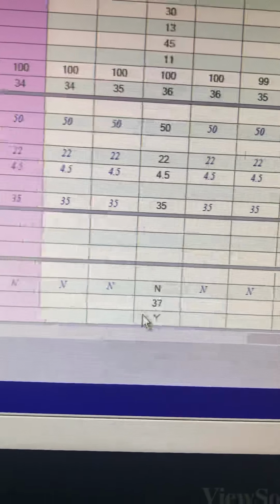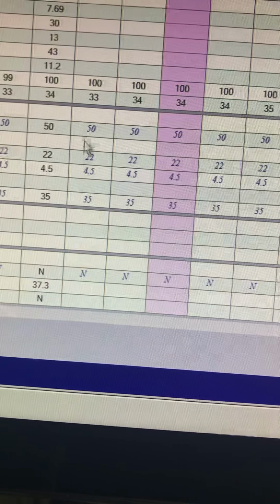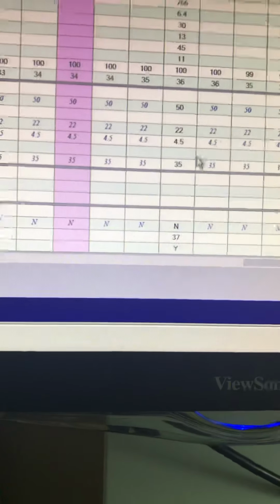As you can see, this is usually kind of how it goes. So, suctioning the patient. We are going to take our suction. It's usually in line already. We can hook this up to the suction canister up on the wall, set it to the appropriate settings, 120, 150. And then we are ready to do the suctioning.